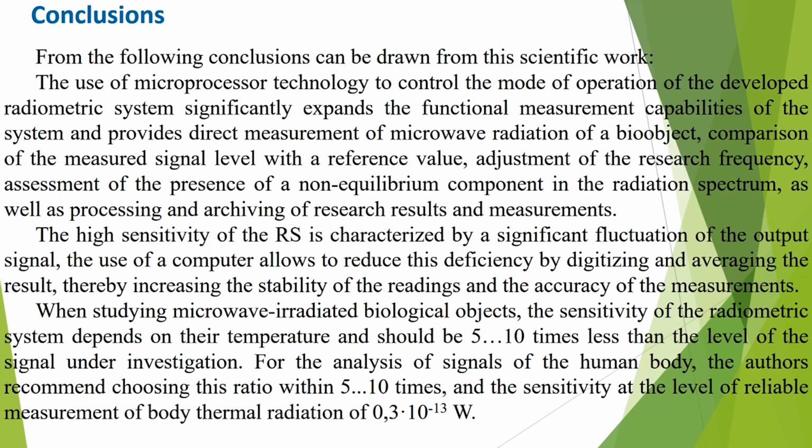Comparison of the measurement signal level with the reference value, adjustment of the received frequency, assessment of the presence of a non-equilibrium component in the radiation spectrum, as well as processing and archiving of the received results and measurements.